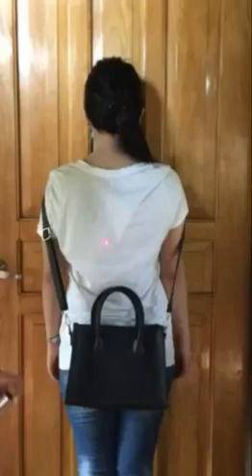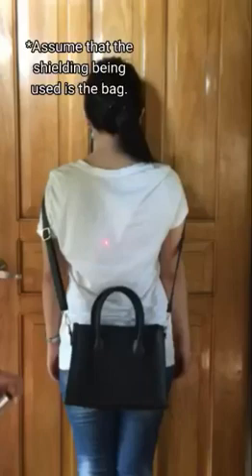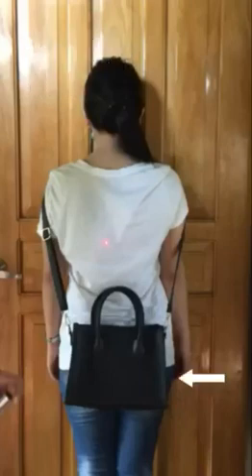Collimation must be closely limited to radiate only the thoracic and lumbar spine. The gonads should be shielded by placing a lead apron at the level of the ASISs between the patient and the X-ray tube.